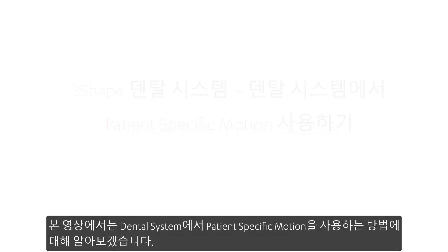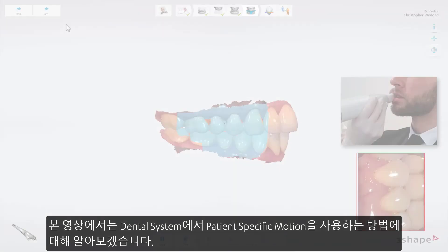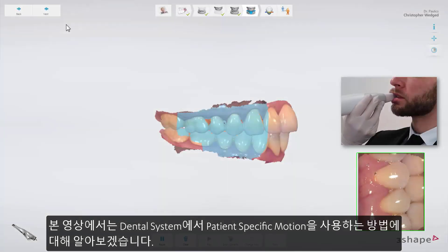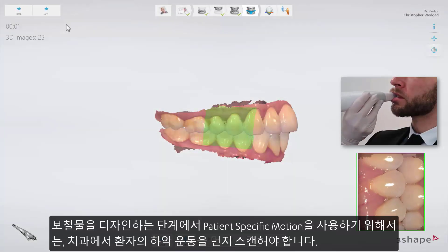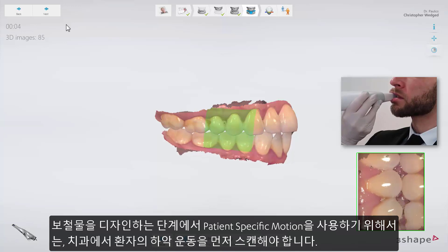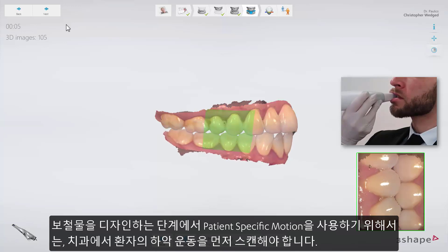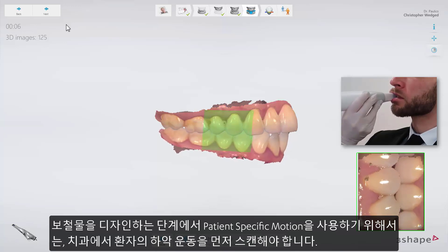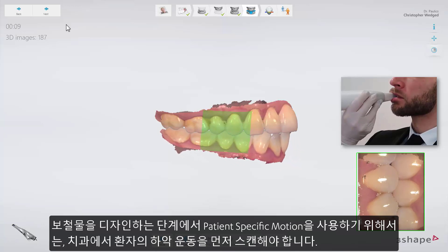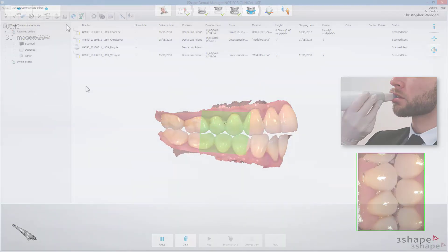In this video, we will show you how to use the patient-specific motion in Dental System. To be able to use this option while designing the restoration, the patient-specific motion first needs to be taken by the dentist during the scanning process.